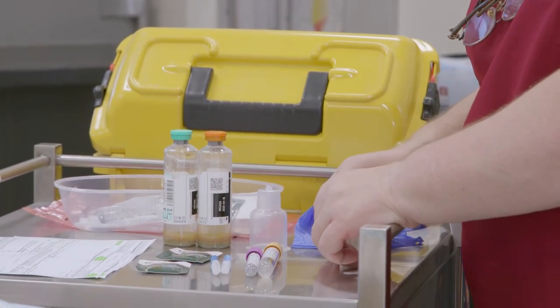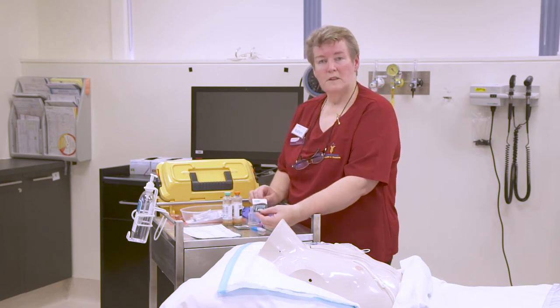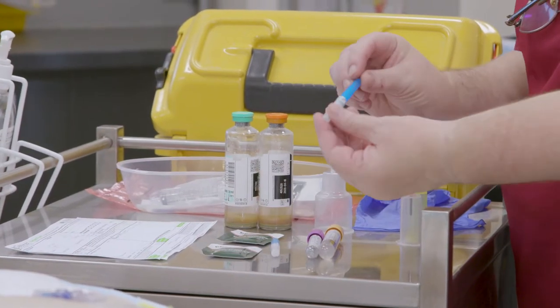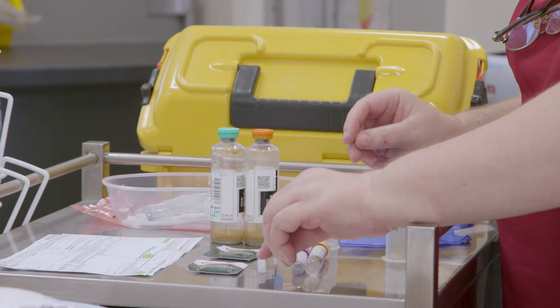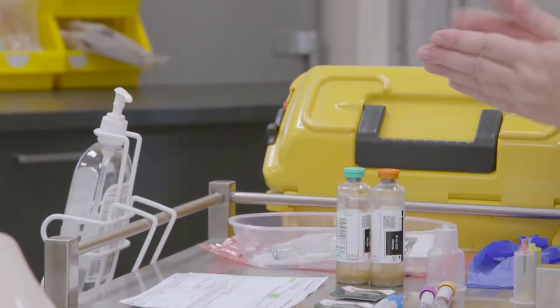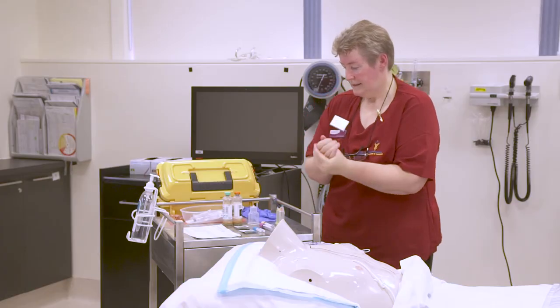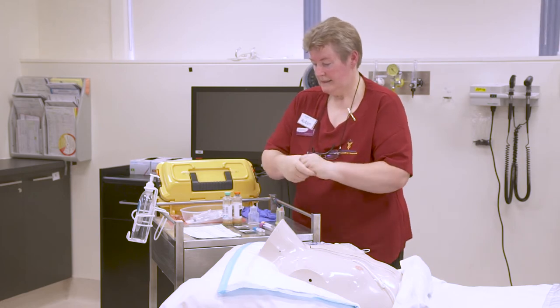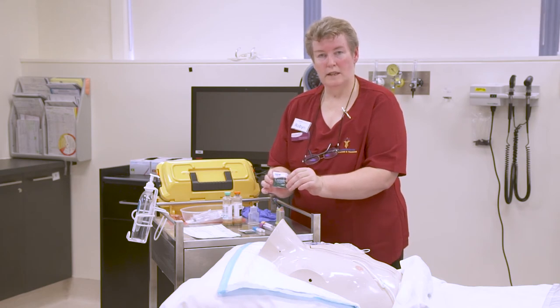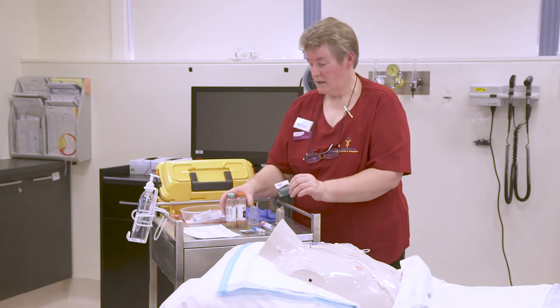However, most times we actually collect using the vacutainer. So certainly we need to scrub the hub for 15 seconds and allow that to dry. And we use the blunt vacutainer needles, which I will show you as I assemble them how that works. So of course I'm going to do my hand wash and set up my equipment. We use the Clinell 2% chlorhexidine and 70% isopropyl alcohol swabs for our medical devices.